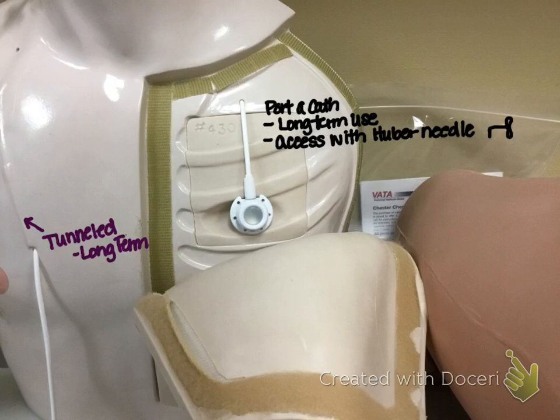here. I wanted to show you really quick the Dacron cuff. And that is the little raised area called the Dacron cuff, and it has antimicrobial properties in it that help decrease infection, and it also helps the tunnel catheter to adhere, because you notice it's not sutured in. So that Dacron cuff will help hold it in. So it kind of adheres to the tissue in the vein.